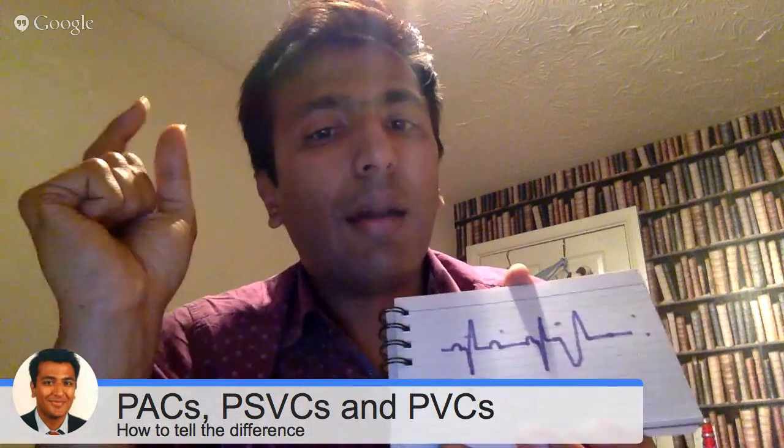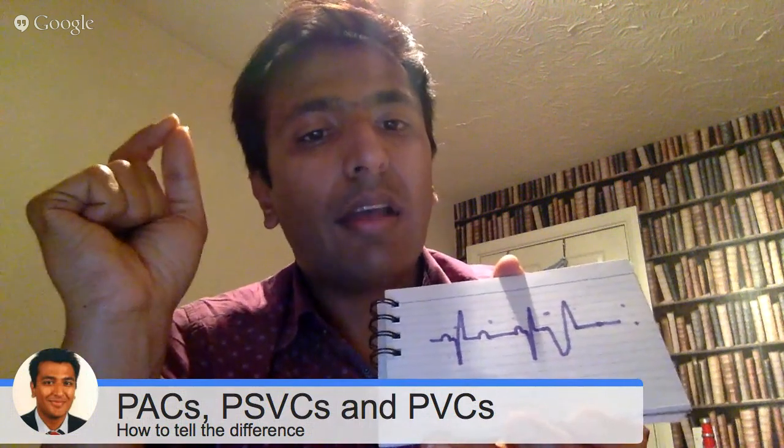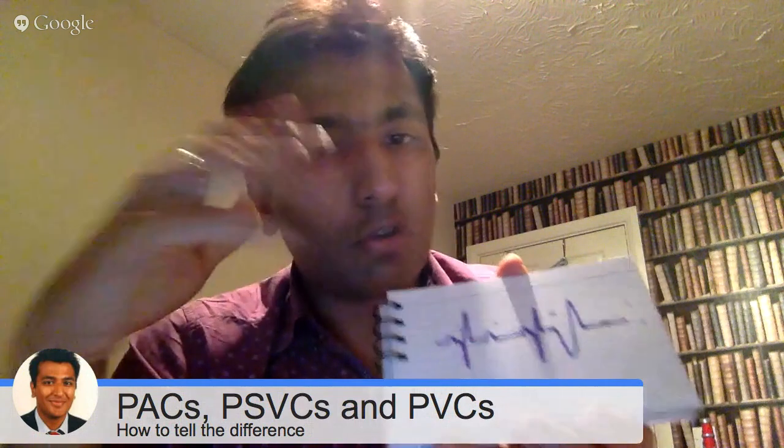Okay, but the big difference between the two is this, that if you have ventricular complexes, then your atria are still doing their own thing, and the ventricle is just releasing these extra impulses. So you will still see P waves, but they will not be related to the QRS complexes.